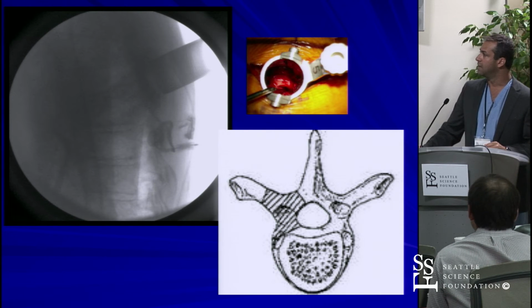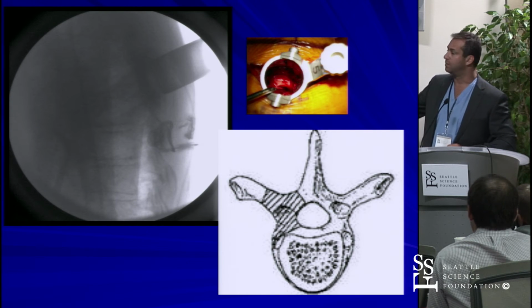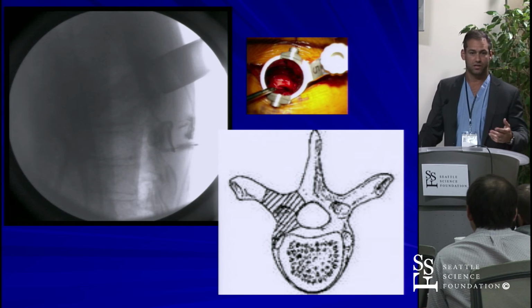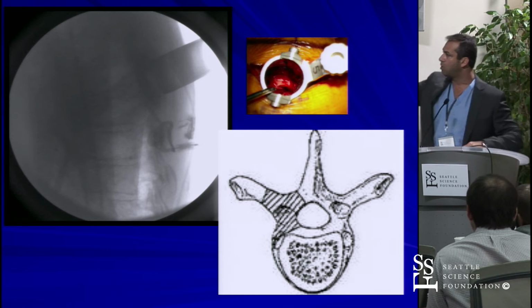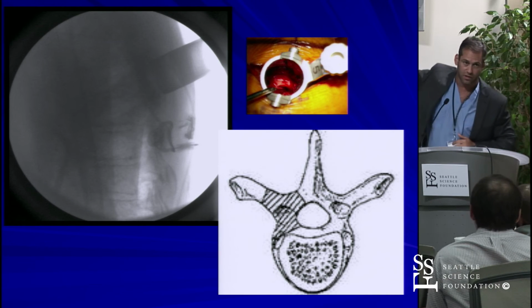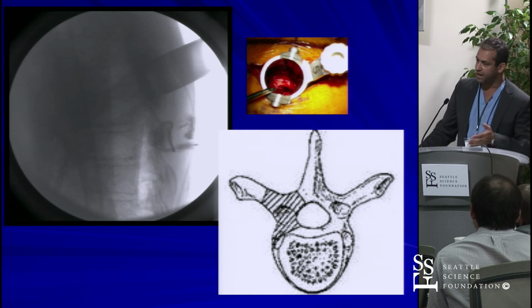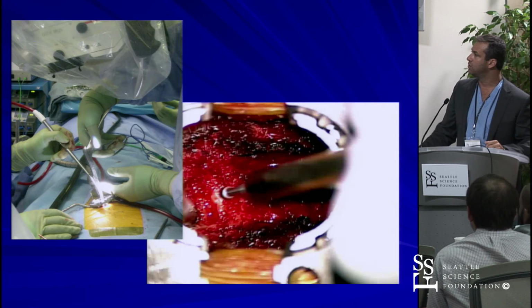and then I start taking the pedicle. And you've got to remember here that you're constrained with a tubular system. You're constrained not only in your visualization, but in your ability to manipulate your instruments, right, by how lateral you go here. So the more lateral you take that TP, the more you're going to be able to wand over your tube, wand over your retractor, and be able to get underneath and more anterior or central, I should say. This video does not work.